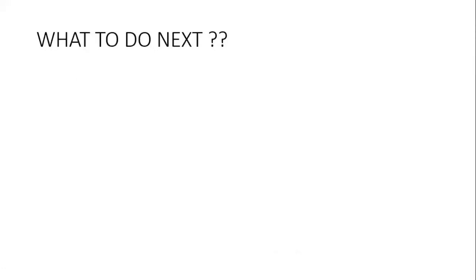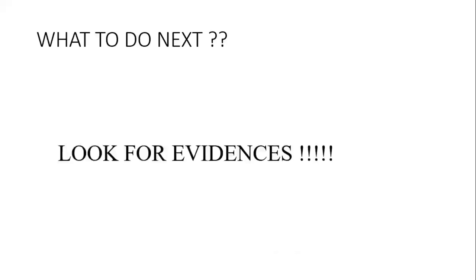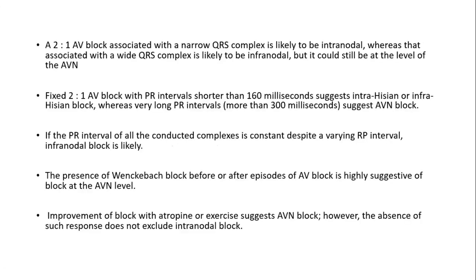It is important because you have to make a distinction whether it's nodal or infranodal. So what would you like to do in this case? Look for evidences — the right bundle is there, so infranodal disease is present. Whenever there's a 2:1 AV block with a narrow QRS, it can be nodal, but with a wide QRS it is more likely to be infranodal, though it could still be at the level of the node.